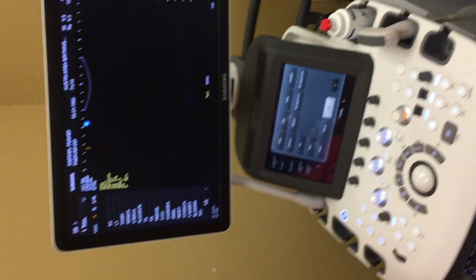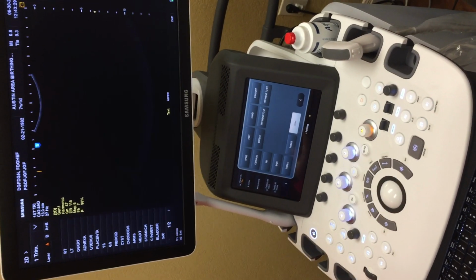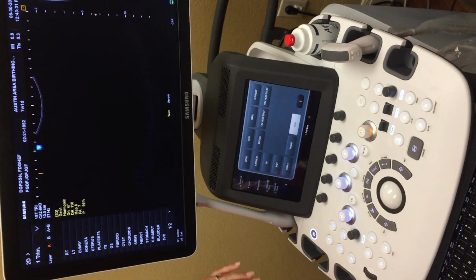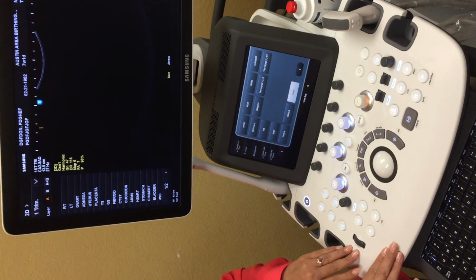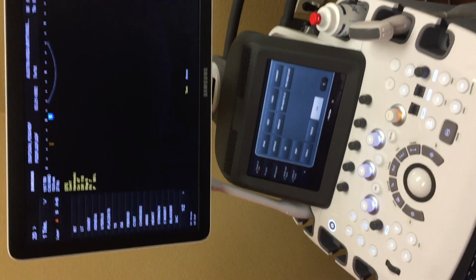Does anybody else have any questions? You're gonna be slow, and that's just to be expected because you're learning a whole new machine. But as you look through, things will make sense, and you're like, oh, okay, yeah, that makes sense. Pretty intuitive.